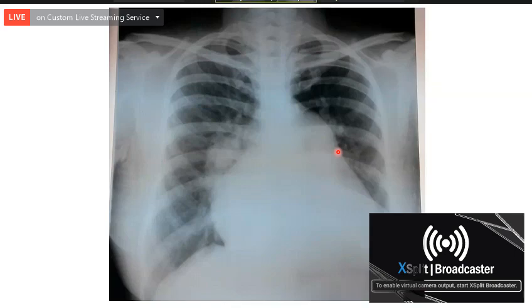No, straightening of the left border you should not describe. You should describe whether there is prominence of the aortic knuckle, prominence of the pulmonary segment, prominence of the left atrial appendage, and the rest of the left ventricle. You don't describe straightening and all. That's not correct. That's only a visual impression. But that does not communicate to the examiner whether you know the importance of the left border of the heart. On the left of the heart, the structures from above downwards are the aortic knuckle, pulmonary segment, left atrial appendage, and the rest of the left border of the heart is formed by the left ventricle.